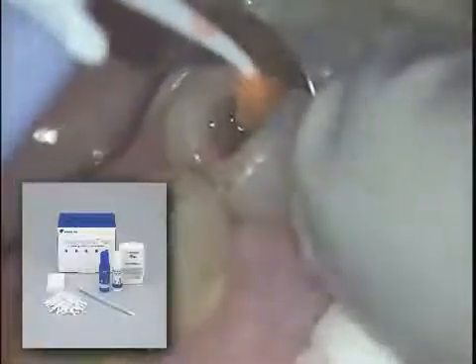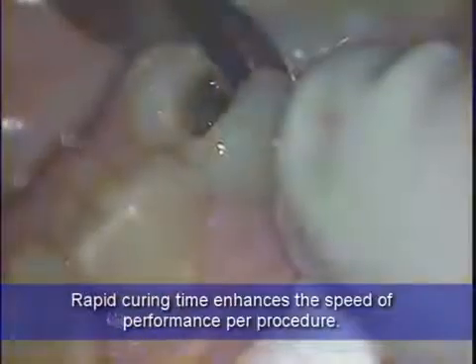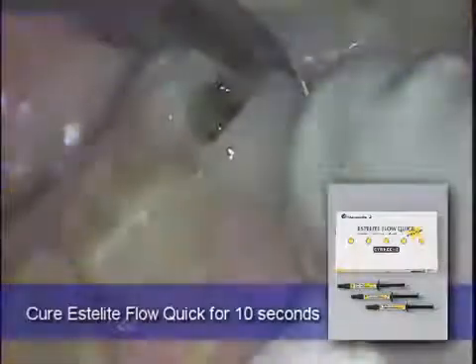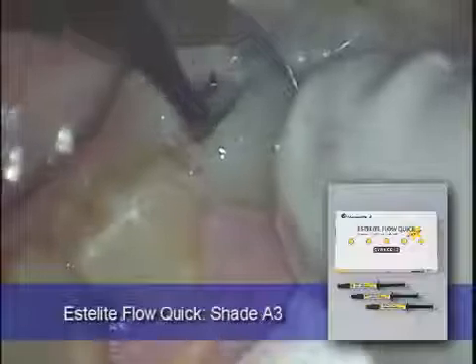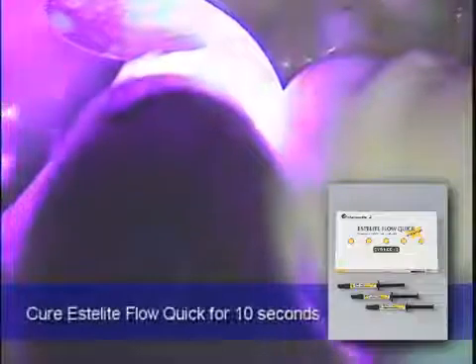The 1-Up Bond F is applied and scrubbed into the tooth for 10 seconds, followed by light curing for an additional 10 seconds. The initial placement of Estelite Flow Quick is placed into the cavity preparation as a partition along the matrix. This is followed by an additional amount of Estelite Flow Quick in 2mm increments, this time placed against the matrix band and along the floor of the cavity preparation.